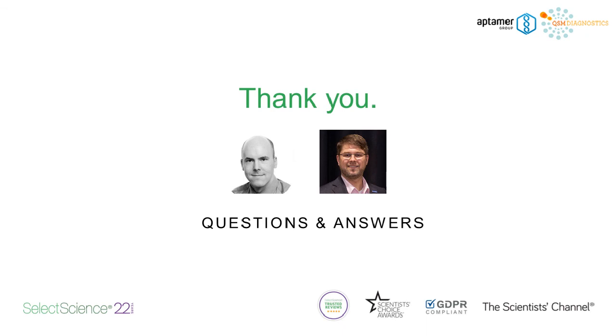Thank you. And perhaps the final question, has there been any work done with saliva? That's a very good question and very topical. The answer is yes. We've actually been working on our COVID aptamer-based test using saliva and nasal swabs as a matrix. And obviously you have to deal with the viscosity issues and so on, but the aptamers do recognize their target in that matrix, yes.